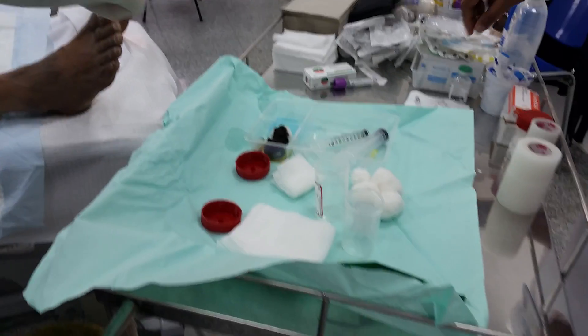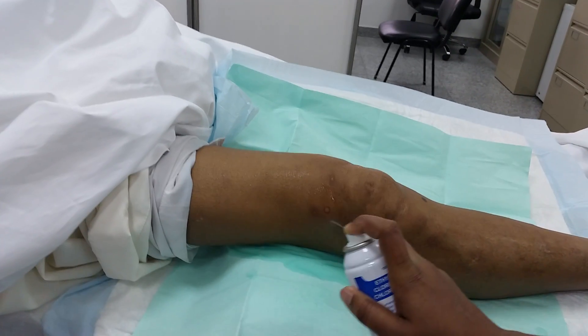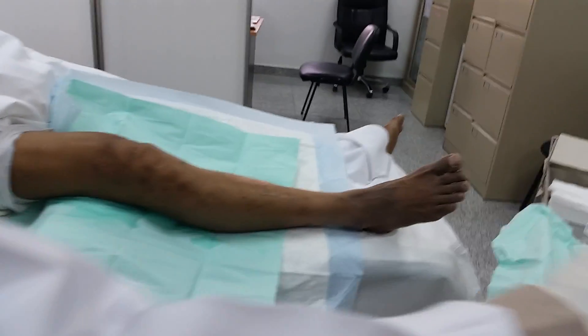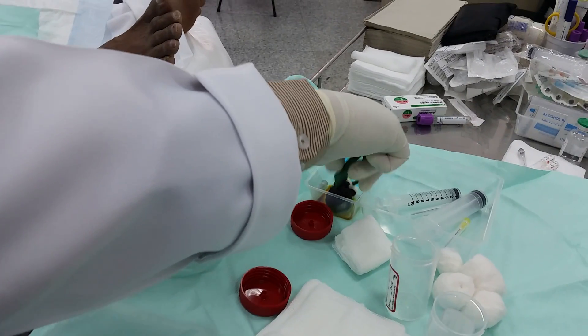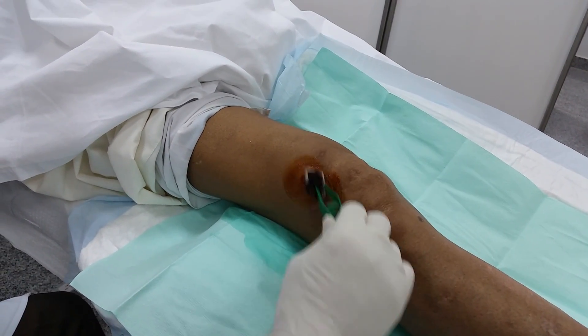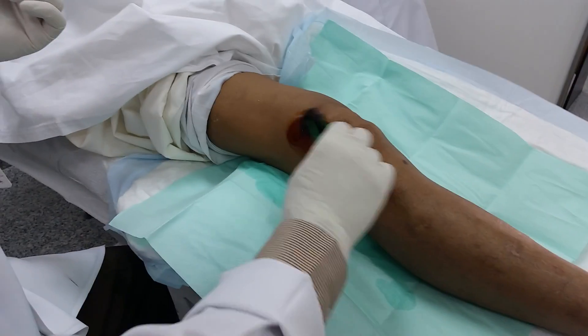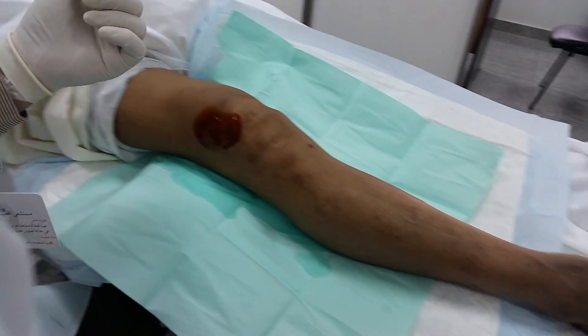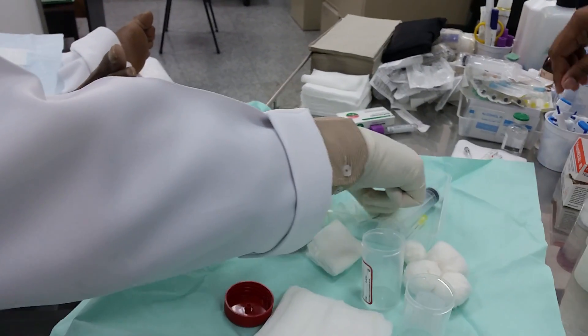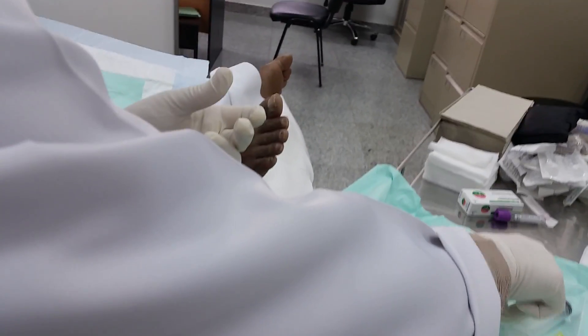My assistant will bring the spray to anesthetize this area. Now this is the final step in sterilization — as the spray is not sterile, I will use a betadine swab to re-sterilize the area with another sterile betadine swab. Now the area is well sterilized. I will use an 18-gauge needle to aspirate.